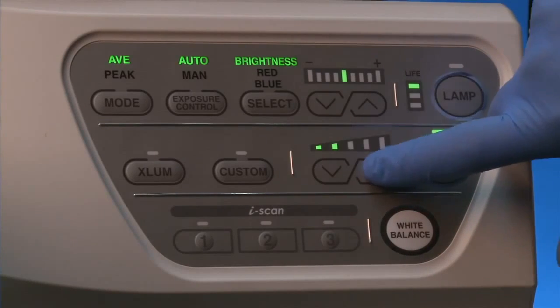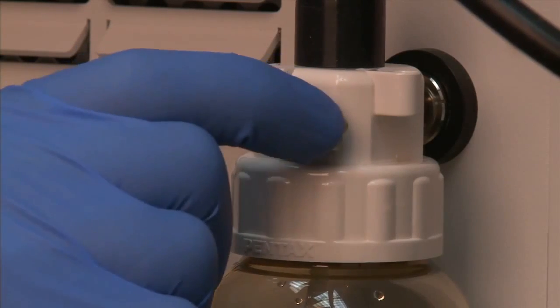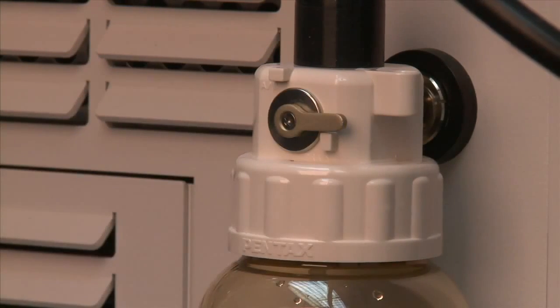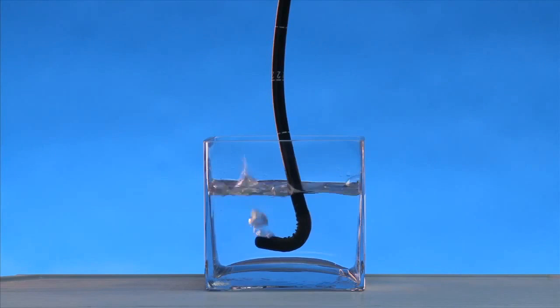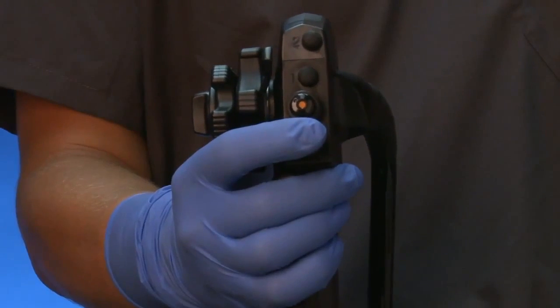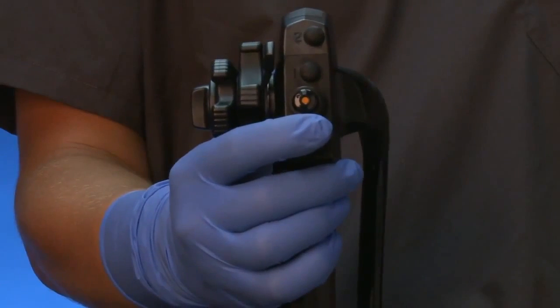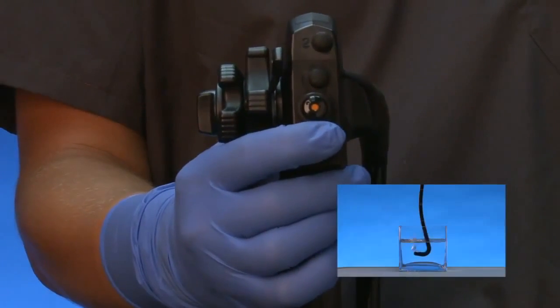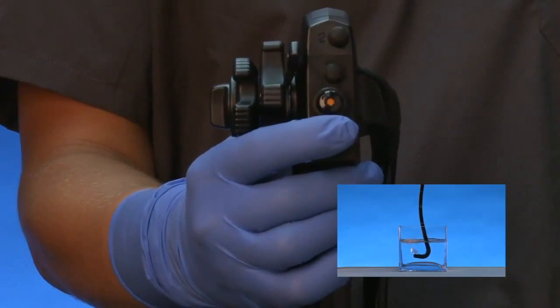Make sure to increase the air pump setting to maximum and turn the water bottle lever to the drain or down position. Next, insert the distal end of the insertion tube into diluted enzymatic solution and cover the air-water valve until a steady stream of bubbles is noticeable. Depress the air-water valve until the water completely drains. A steady stream of bubbles should be noticed at the distal end.